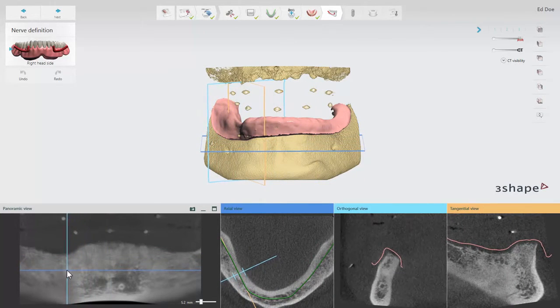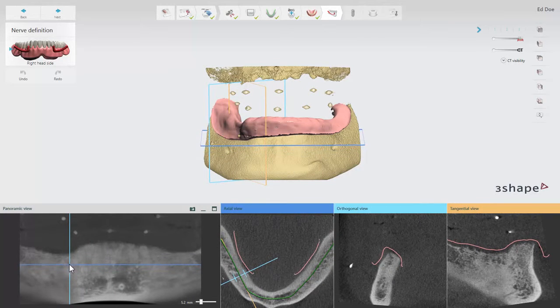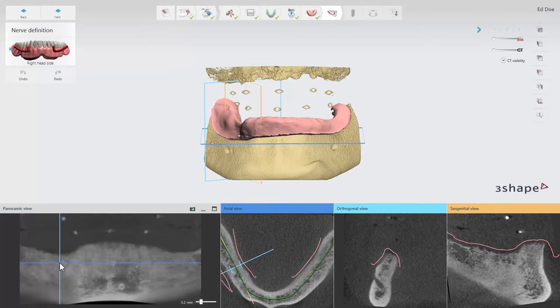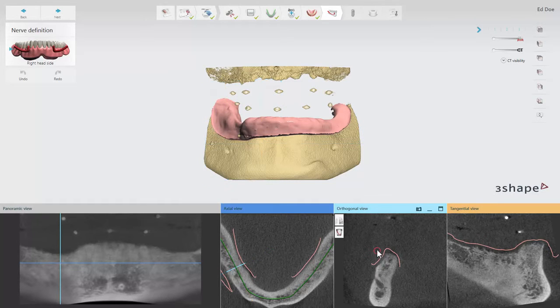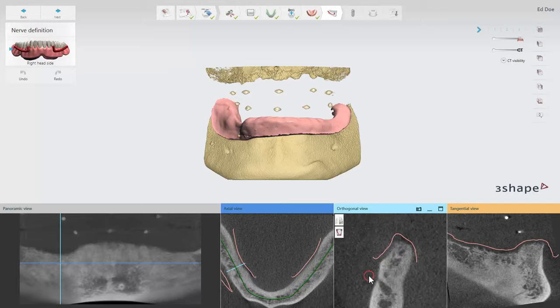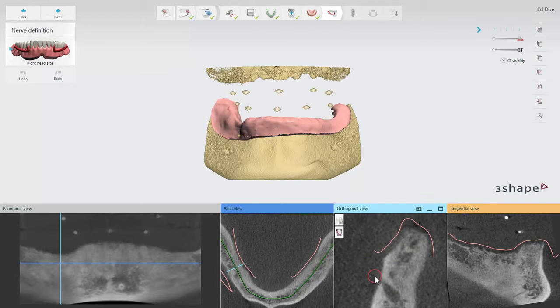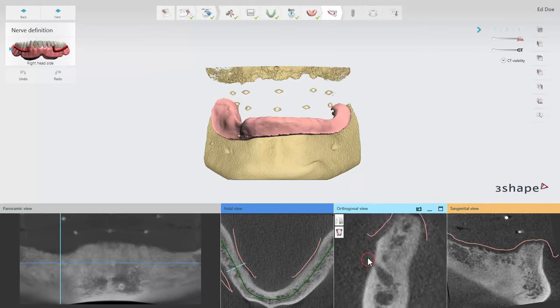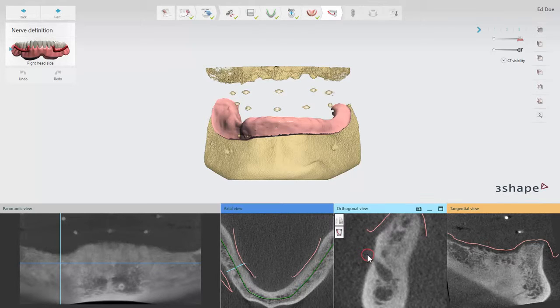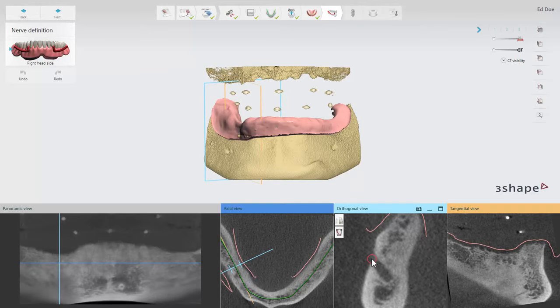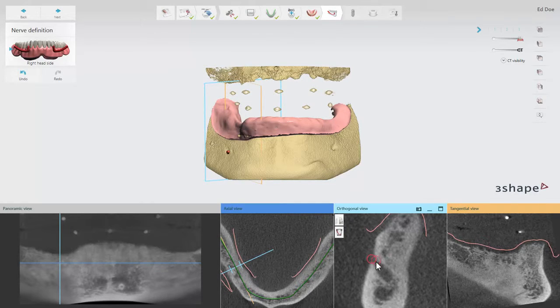In the Panoramic view, drag the blue plane sideways to move along the scan and find the best position to view the mental foramen. After finding the mental foramen, left click on it in the Orthogonal or Tangential view to start defining the nerve. To move through the scan, move the cursor over the view and scroll the mouse wheel while pressing down CTRL.